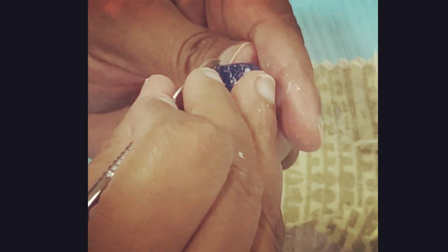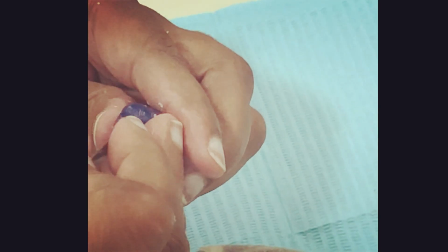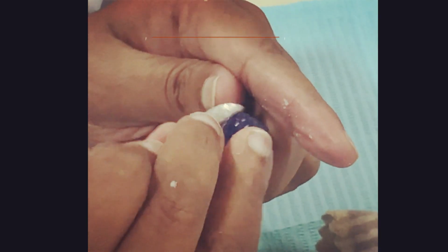There's a difference in the height also, okay, for the buccal cusp, mesiobuccal, then disto, and then the distal. But even if you don't do that, it's okay, because sometimes you'll end up reducing too much and then it won't even look like a tooth anymore. So, but just know from the theory point of view that even the height of cusps change on the buccal side. Lingual, they're almost equal.